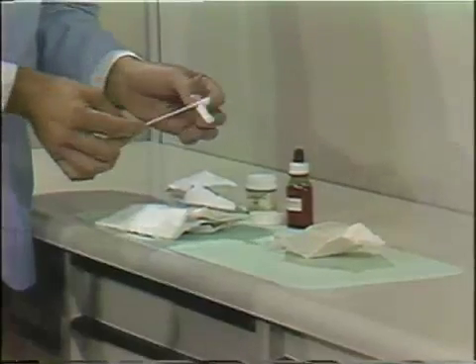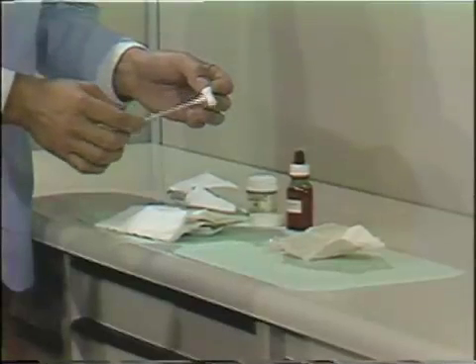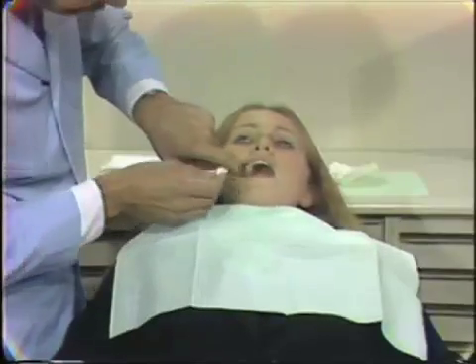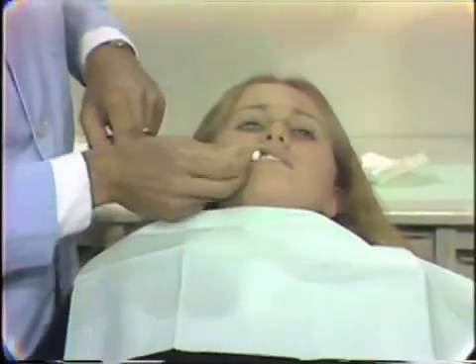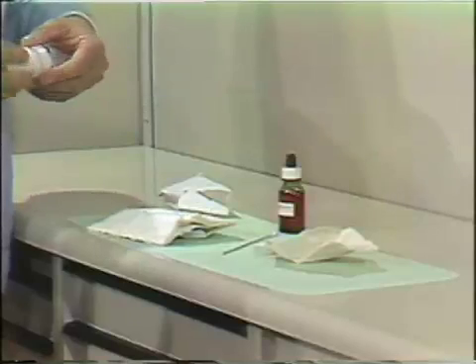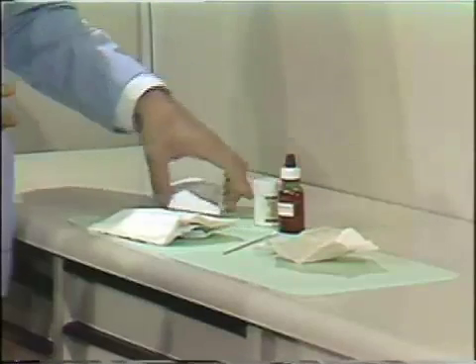If you have some topical xylocaine — there's topical xylocaine as a gel available at the desk — you can place some of this on the side of a cotton roll and go to the patient and place this in the area of injection, tucking it up into that area. If you do this before you start to load the syringe, by the time the syringe is loaded, the material will have a chance to take effect. If you wipe on the topical anesthetic and do the injection immediately, it never has a chance to take effect.